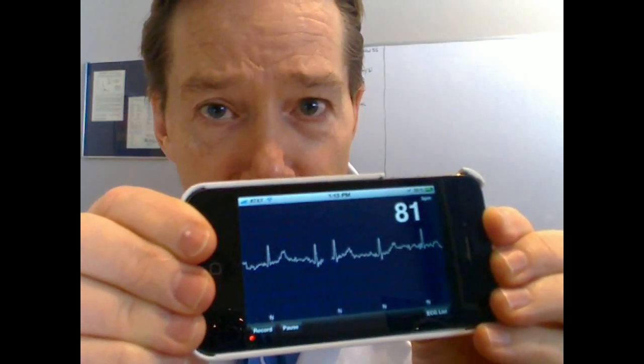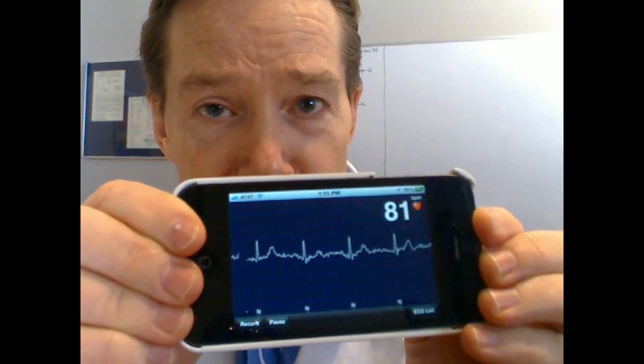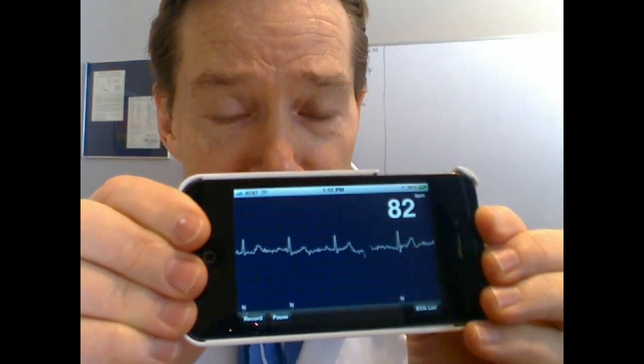You can see the P waves and I'm not holding it very stable. If I was holding it in my lap, it would be a completely clean ECG.